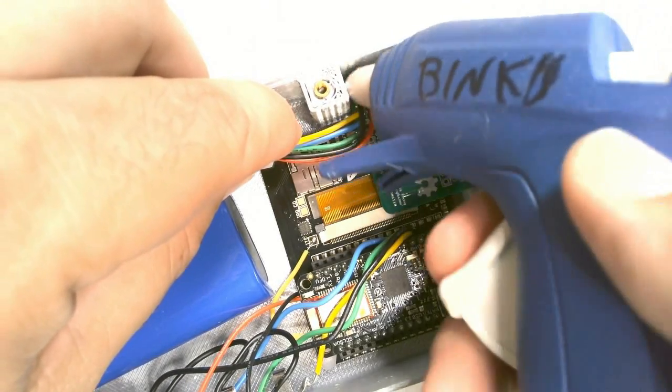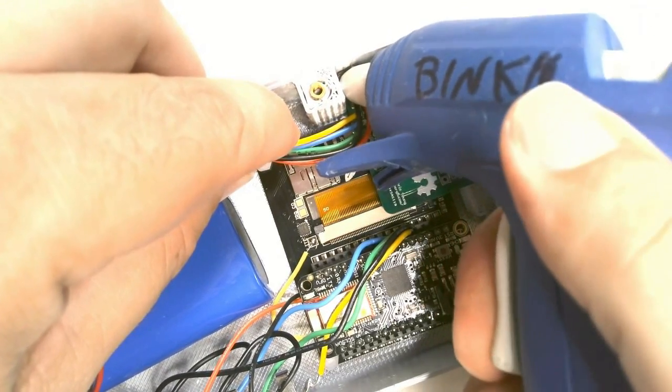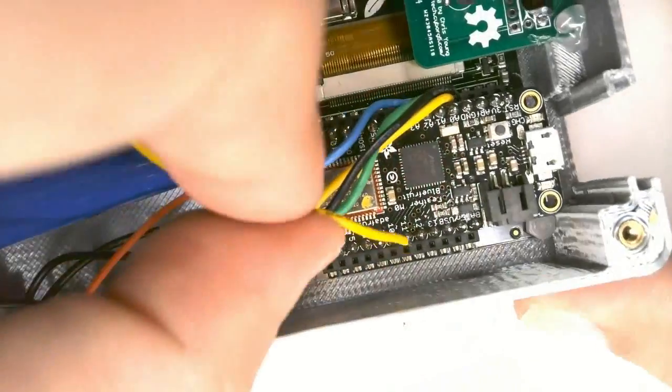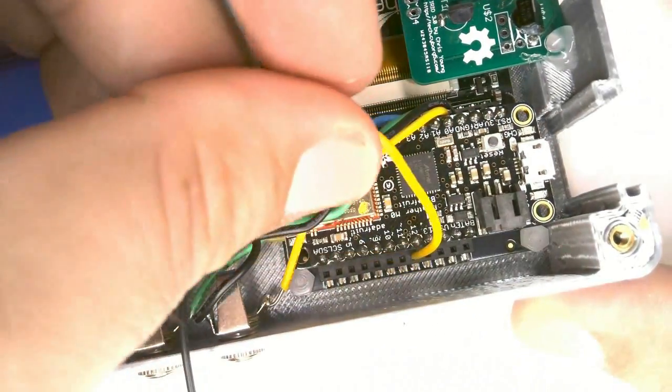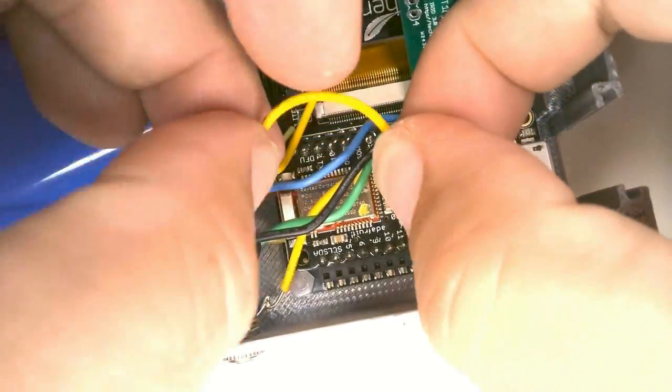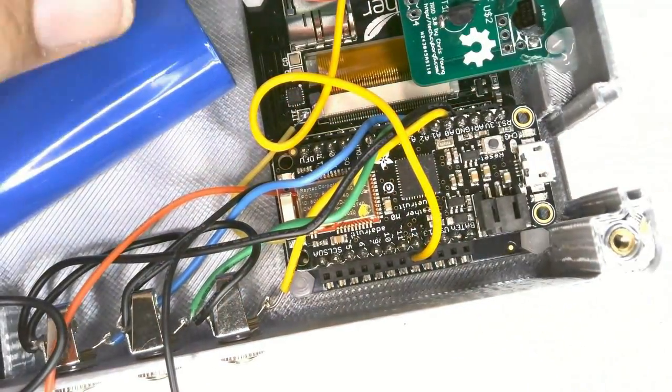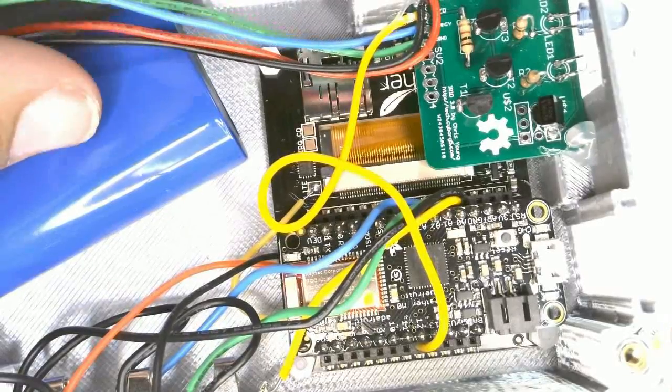This particular board was constructed with two receiver components that we're not going to use or wire up. See the tutorials for details. Take the yellow wire from the IR board and plug it into pin number 12 adjacent to the feather board.